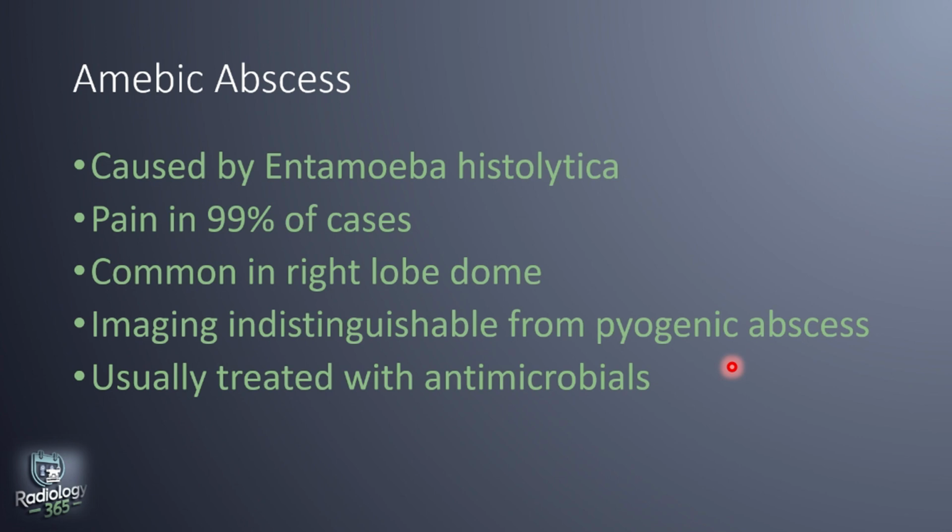So just go back and look at how pyogenic abscesses look. Amoebic abscesses also look basically the same. It's just found out on aspiration and culture. The good news is antimicrobial treatment alone usually works, and drainage usually is not even needed.